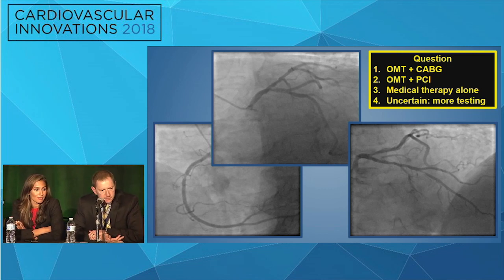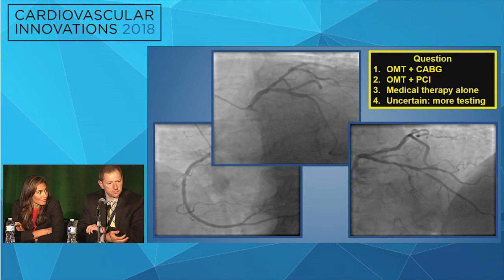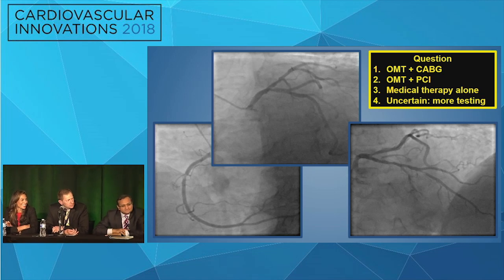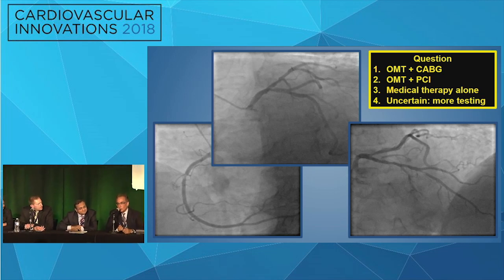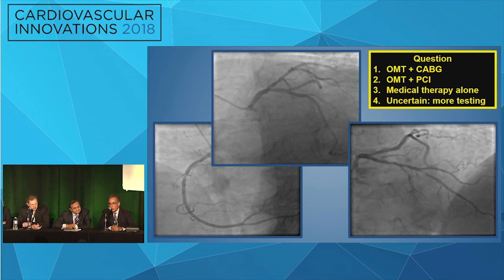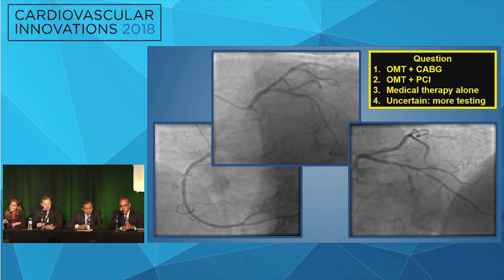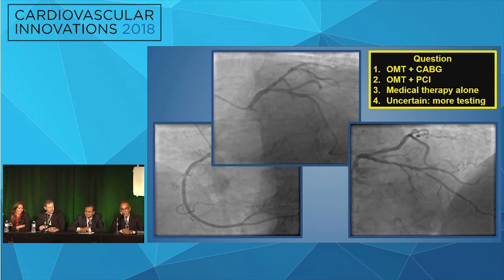Shami, should we be doing iFR or FFR on these? Maybe the combination. Let me start one step back: for patients like this, consider CT FFR so that you can actually avoid an invasive study. That's a possibility. But if you're on the cath table, I almost always end up using both iFR and FFR. I would remind everybody, 0.81 FFR versus 0.79 FFR, even though the data was on that 0.8 cut point, it's never that dichotomous.